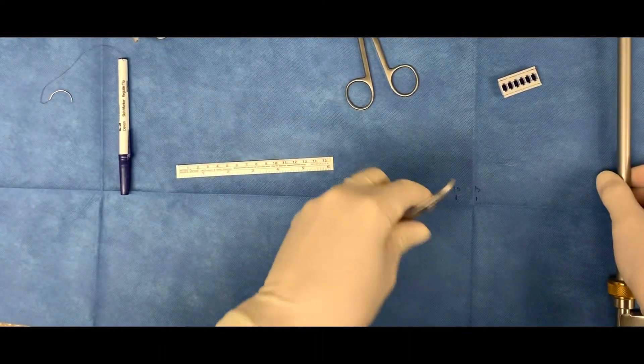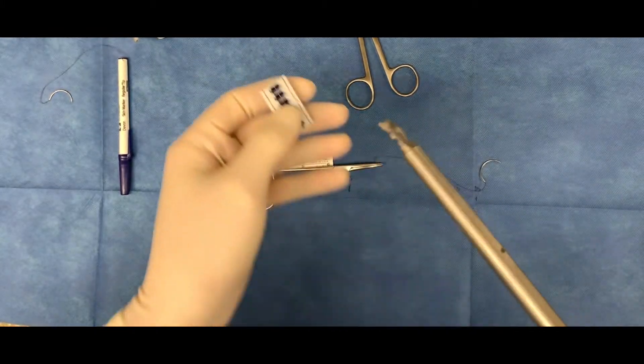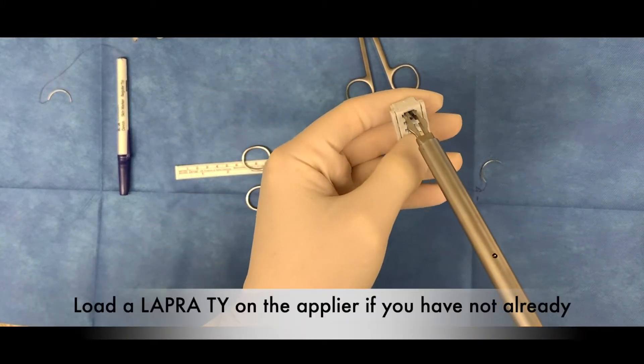Once you have tied the knot, keep your clamp at the end of the suture. This will help you actually keep the suture taut when you're applying the Lapra tie.